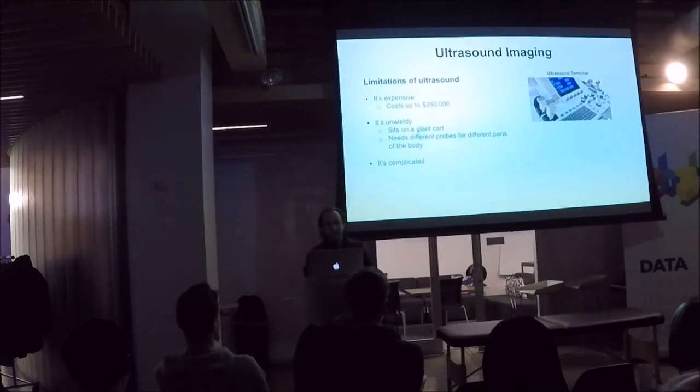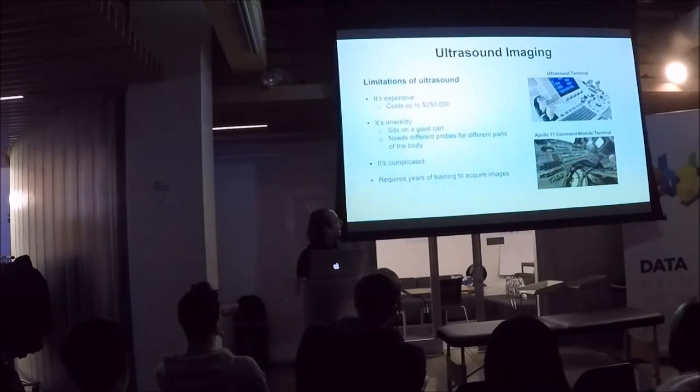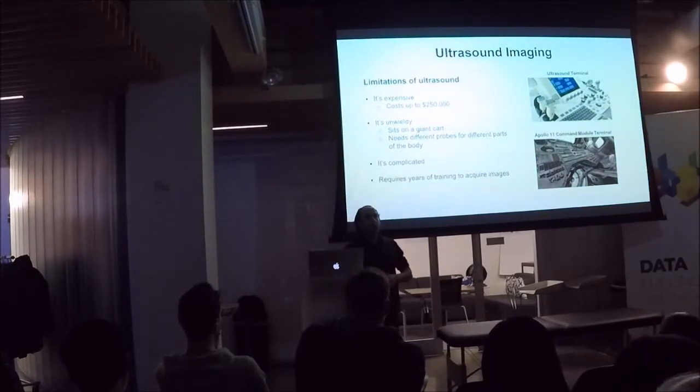Ultrasound devices or systems themselves are very complicated. So this is just an image from one of many types of popular ultrasound systems. For reference, this is the Apollo 11 command module. So this is what I always think about whenever I see one of these big systems. It requires years of training to acquire images.